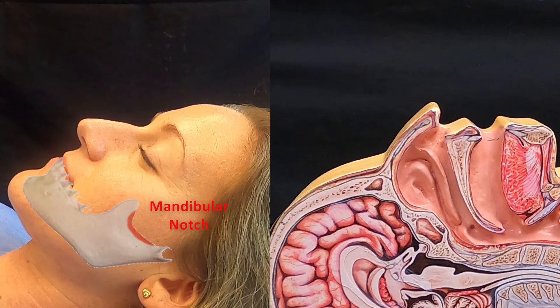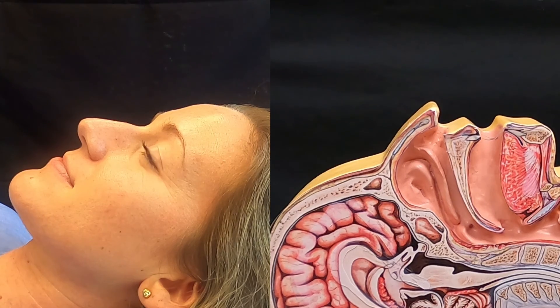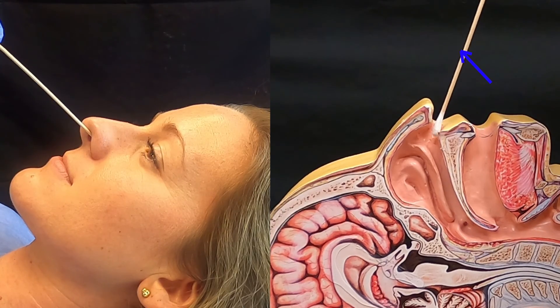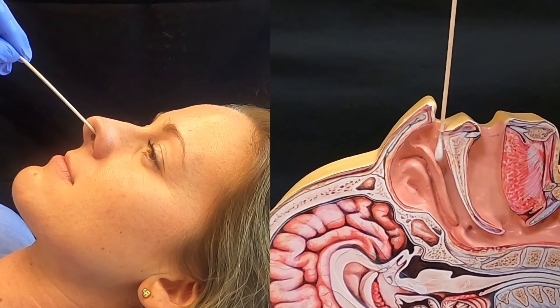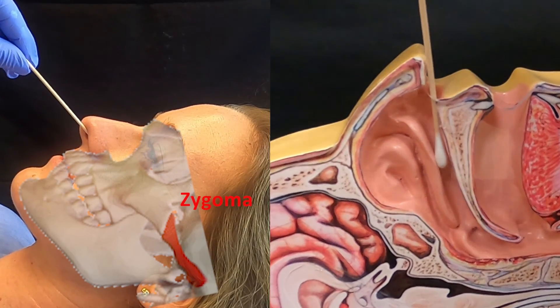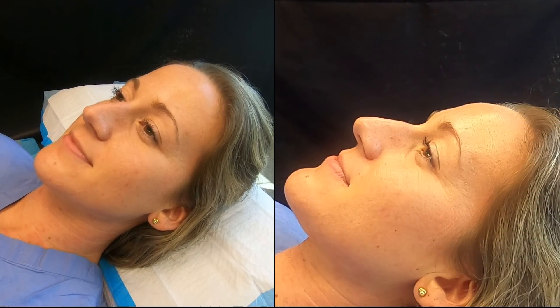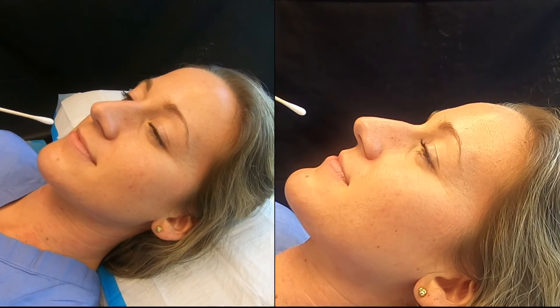The cotton-tipped applicator that was previously soaked in local anesthetic is advanced into the naris. Ensure that the applicator is advanced parallel to the zygoma, following the superior border of the middle nasal turbinate. The applicator is advanced slowly with steady pressure until resistance is met.